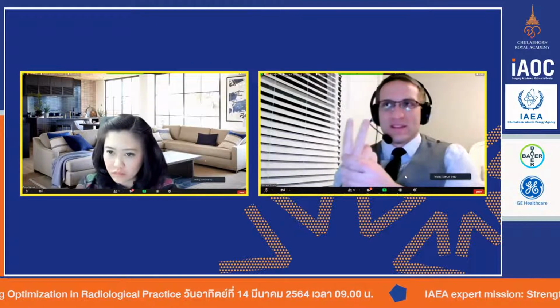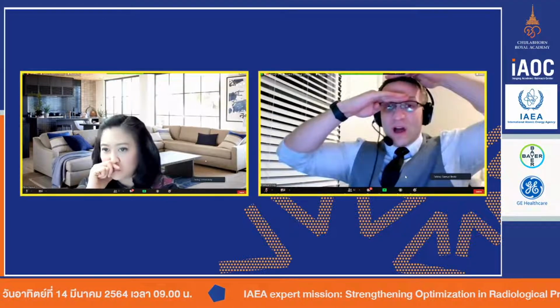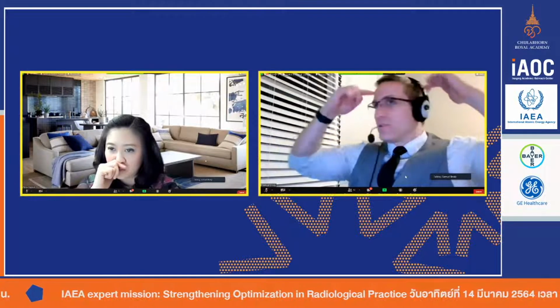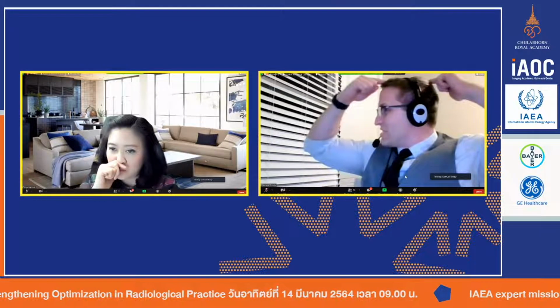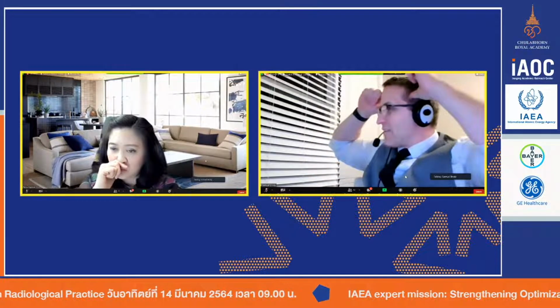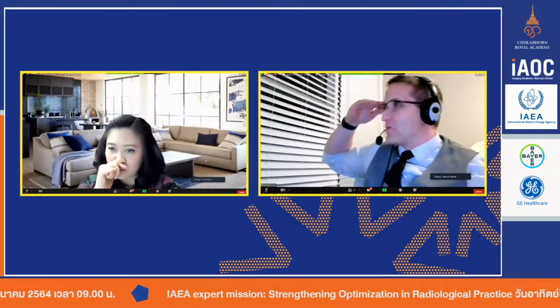There are 2 ways to think of it. There's the scan field of view, which is the overall anatomy that we're going to image. Obviously, that will affect dose. If you have auto MA, and looking sideways here, I'm thinner here than I am here, it's going to use less dose here than here. So depending on how thick my scan field of view is will depend on ultimately how much radiation is going to be used.